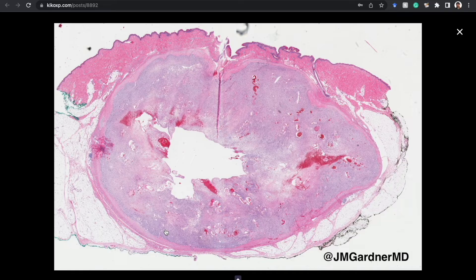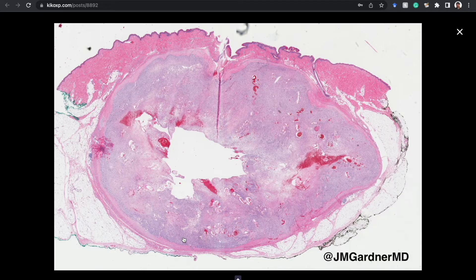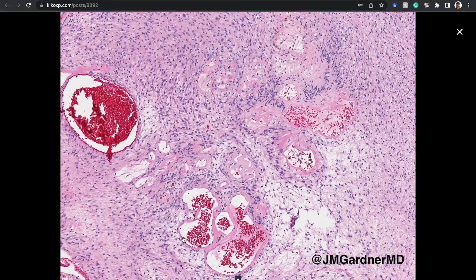The capsule — if you stain for a perineural marker like EMA, GLUT1, or claudin-1 — usually contains perineurium mixed with fibrosis. Schwannomas arise inside a small or large nerve, grow, push outward, and the perineurium expands and fibrosis creates the capsule. You'll often find multi-layered perineural cells in the capsule. I don't routinely do those stains but I've done it for teaching and it usually works nicely. There are also nicer Verocay bodies here — not perfect but pretty good.